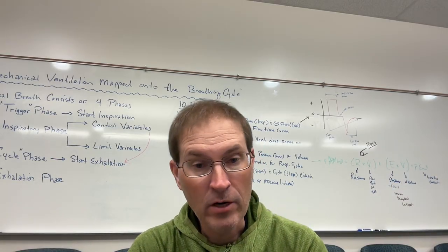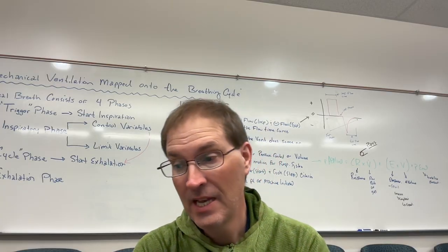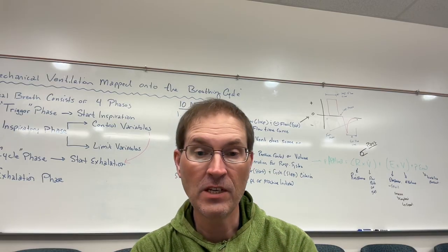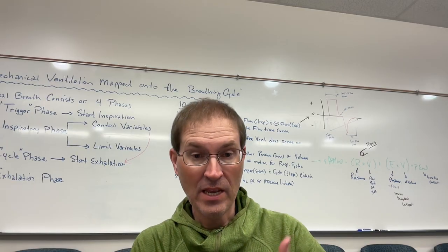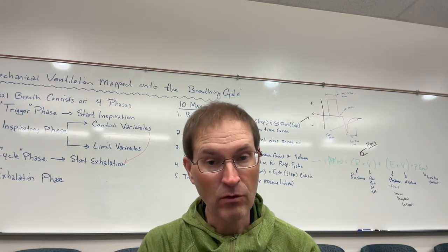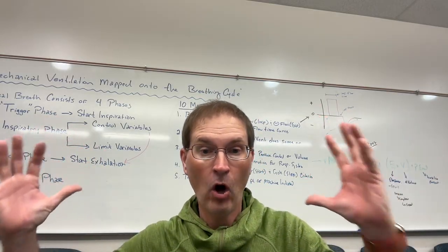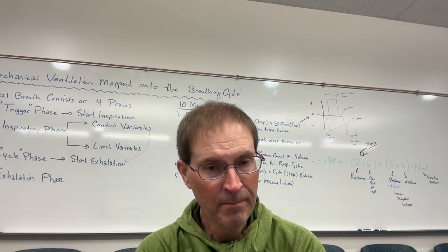The name of that article, if you want to reference it, is A Taxonomy for Mechanical Ventilation: 10 Fundamental Maxims. And I'm going to talk about each of the 10 fundamental maxims, because this is how we get into the nitty-gritty of defining mechanical ventilation and how we understand the concept of a mode of mechanical ventilation and all of the various settings associated with that mode.